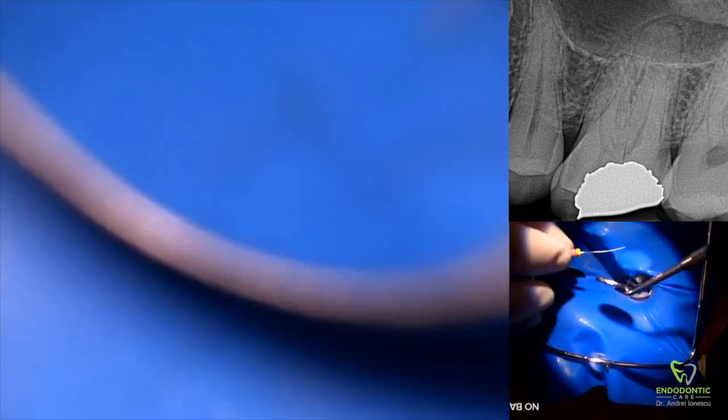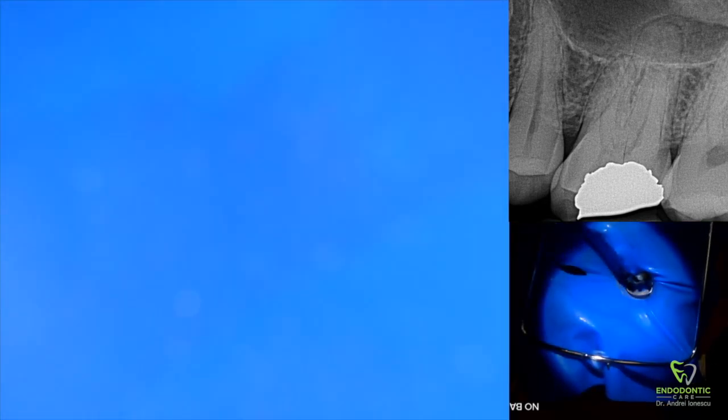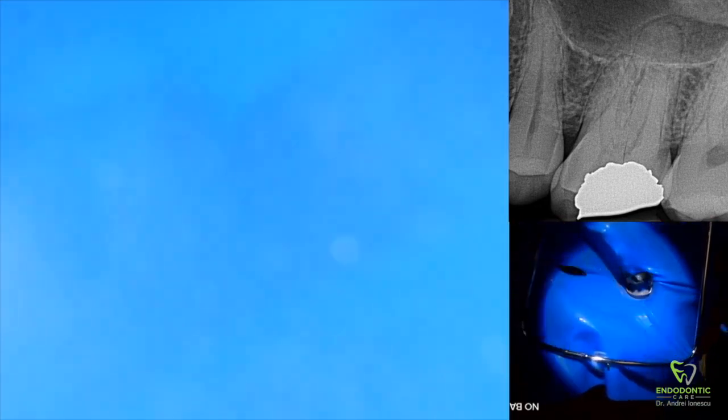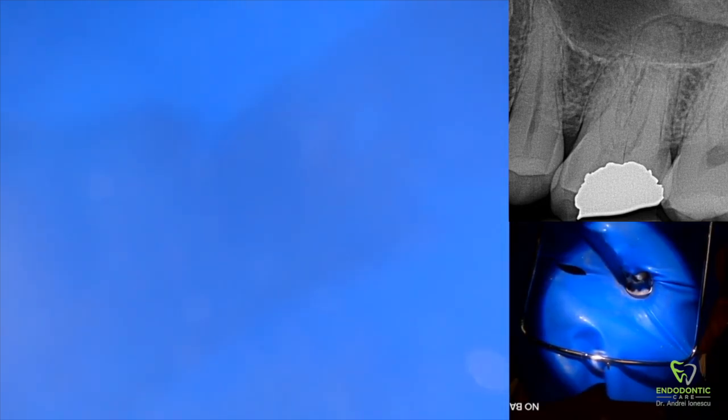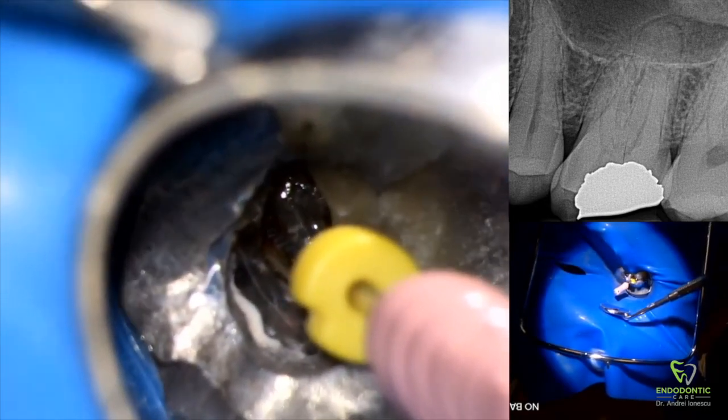Just by looking at the x-ray we can tell this is a normal-length root, so you're probably looking at anywhere between 19 to 23 millimeters. I'm not overly concerned about over-instrumenting at this point — if I go through the apex a little bit, it's not the end of the world. Once we notice the file has passed through the apex and we feel it getting a little bit looser in the canal, we can start to measure and take a preliminary working length.